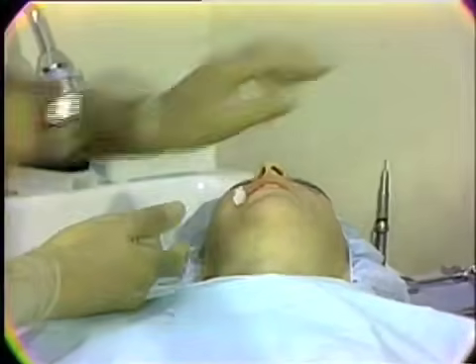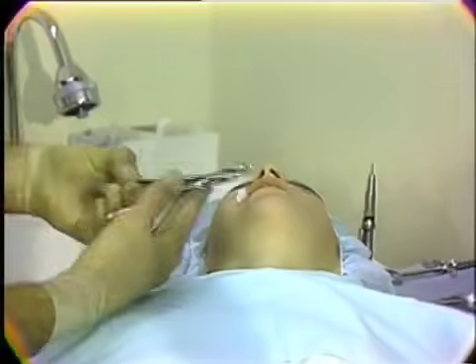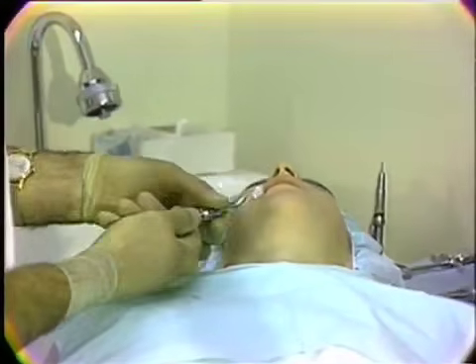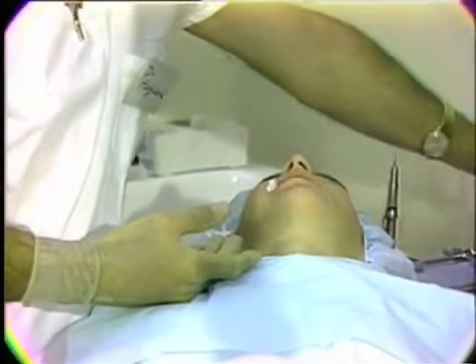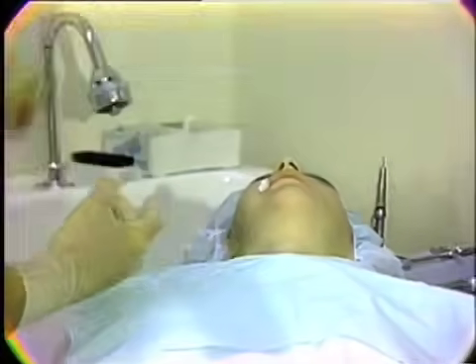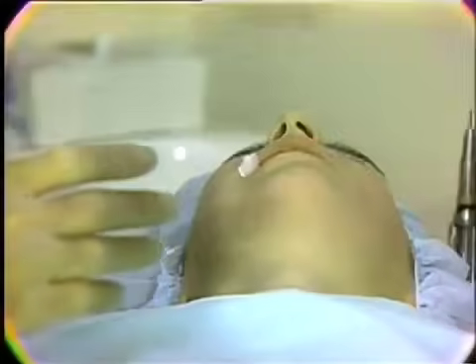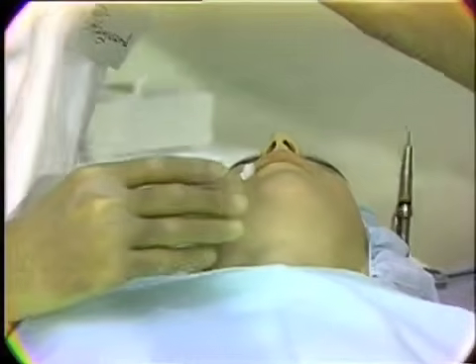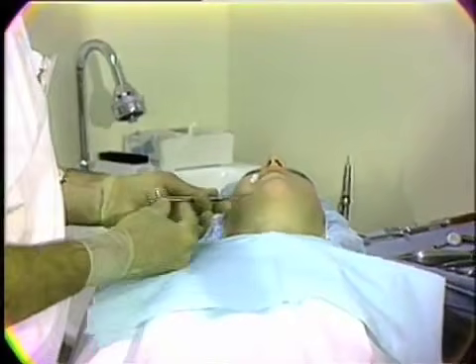In the alveoplasty, we would use the Rongeur forceps that are used to contour that, and the filing of the bone done with a double-ended bone file as we are finally contouring the bone beneath the flaps. Then the soft tissue flaps are trimmed so that there are no excesses and pathology is removed, trimmed with scissors, and then the sutures are placed.